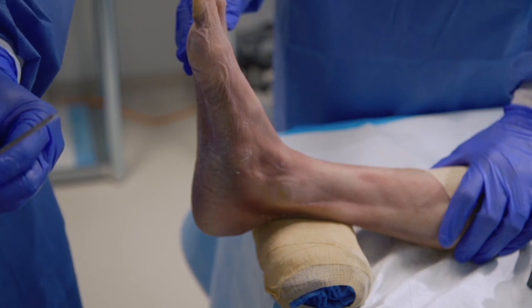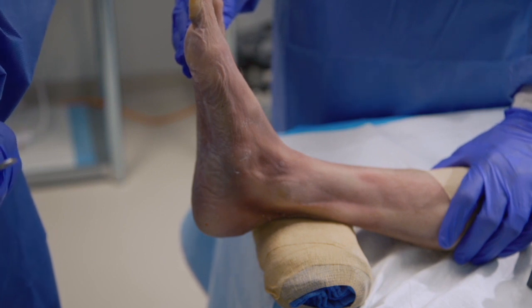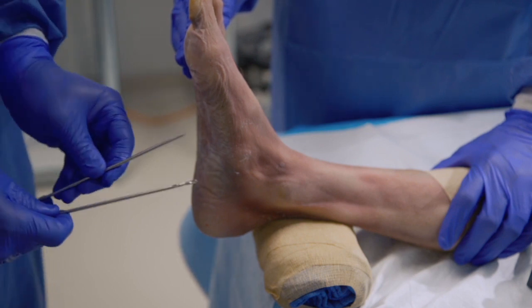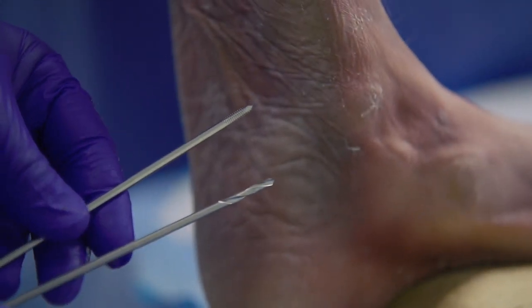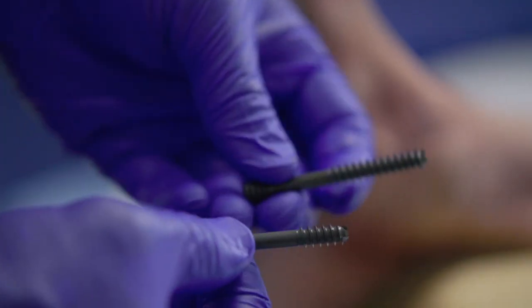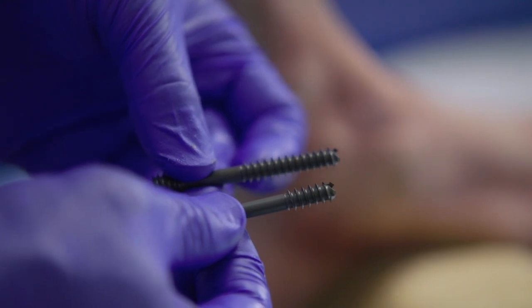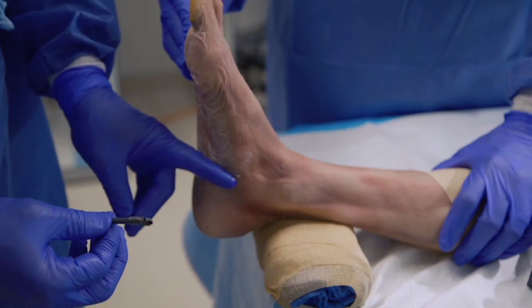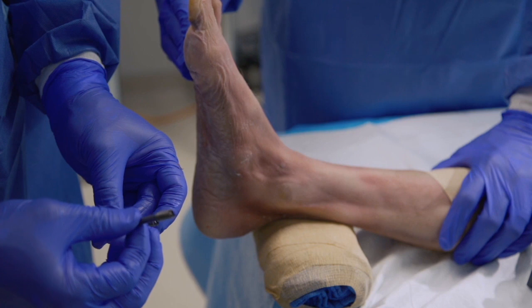The fixation construct being utilized is two cannulated Fixos II screws, 7.0 millimeters in diameter. The Fixos screws also come in 4.0 and 5.0 millimeters in diameter. There are two types of cannulated screws in the 7.0 Fixos II — headless compression screws — one with a long thread pattern and one with a short thread pattern. When placing screws from the calcaneus into the talus, the short thread pattern is typically used to ensure all threads cross the arthrodesis site and provide maximum compression.